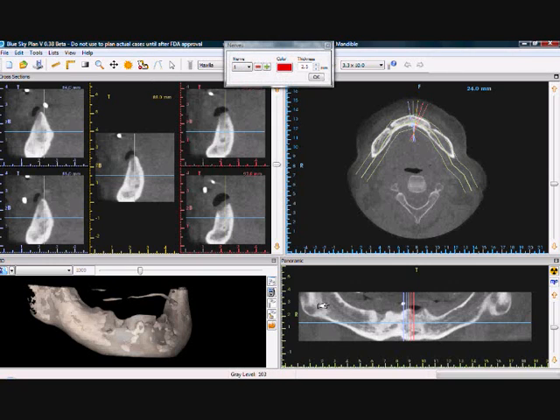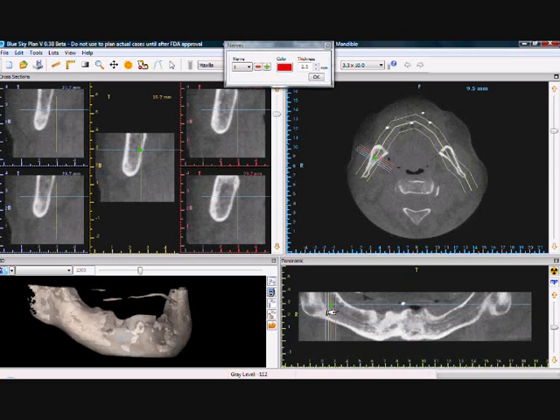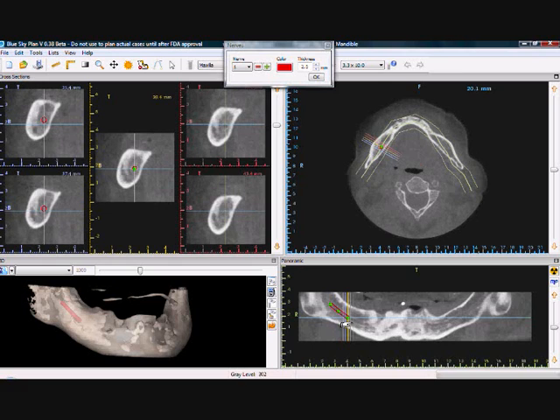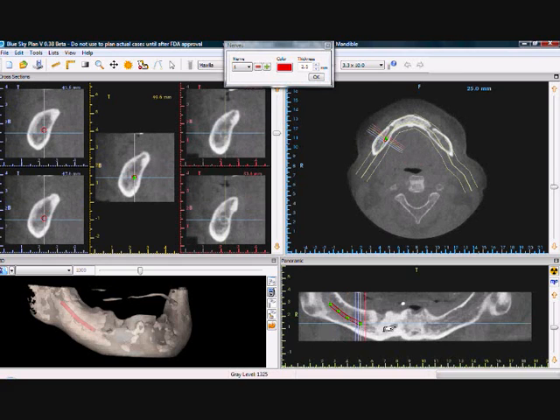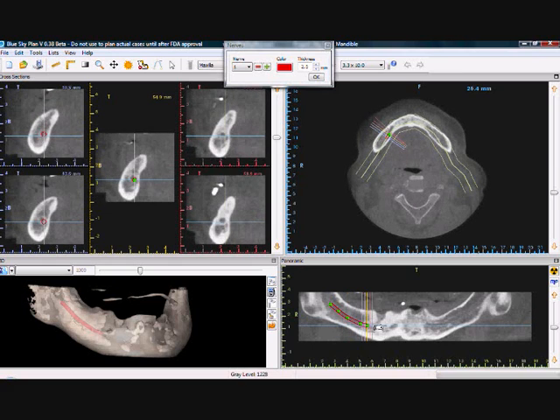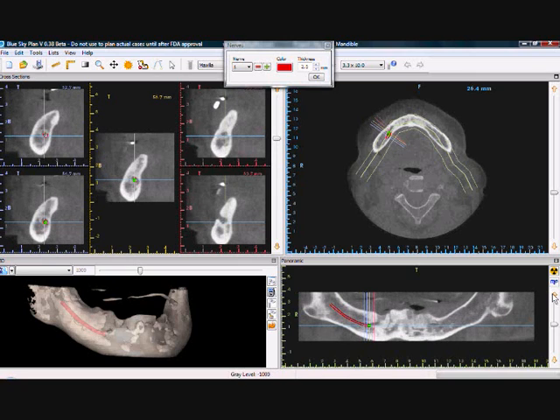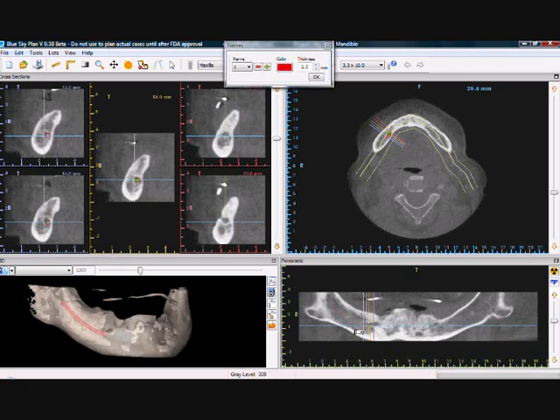The nerve is drawn by placing dots along the nerve canal and the software automatically connects the dots, drawing the nerve. We are able to flip through the panoramic slices, moving buccally as we continue to draw the nerve, pulling the nerve buccally as we go.